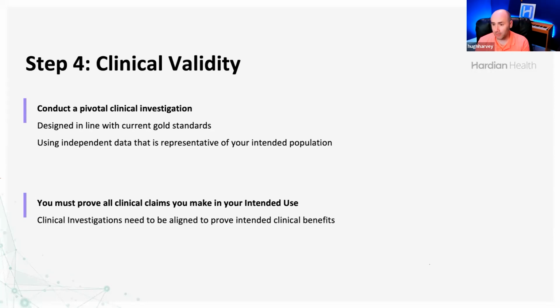Another question then from the chat, which is moving so fast. Another question from Helena. For AI-based medical devices, can you explain when retrospective or prospective data should be used in a clinical investigation, or should it only be prospective data? We will come on to that, but in essence, in your early feasibility study, it's absolutely fine and probably expected and best practice to use retrospective data.